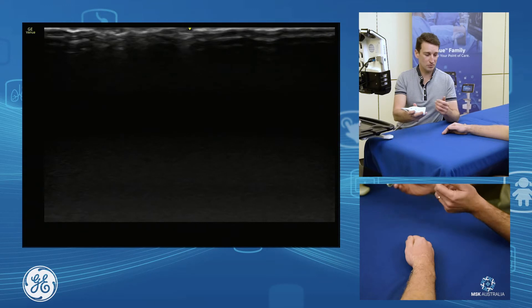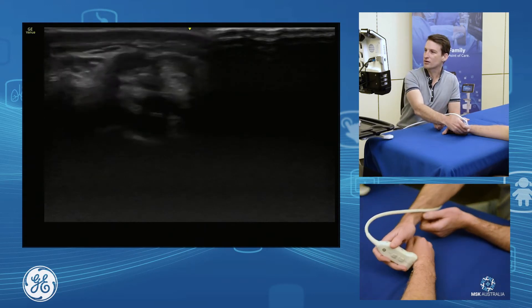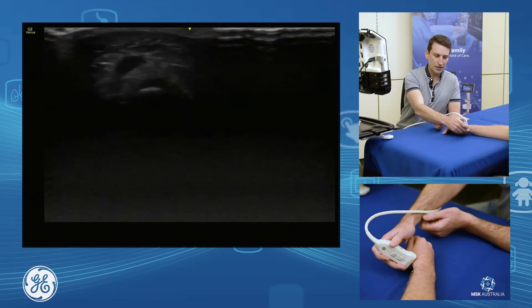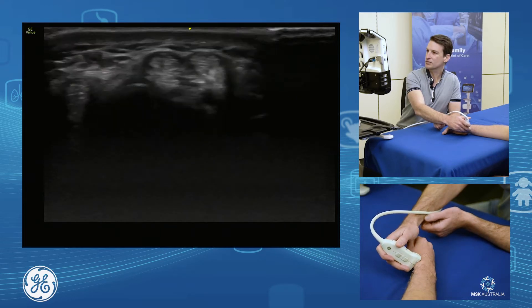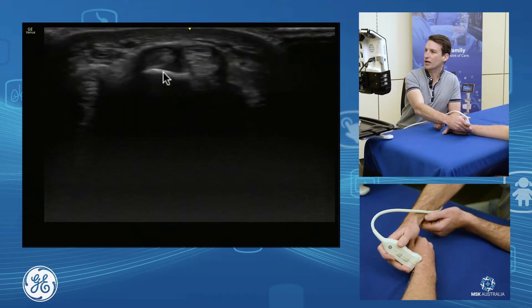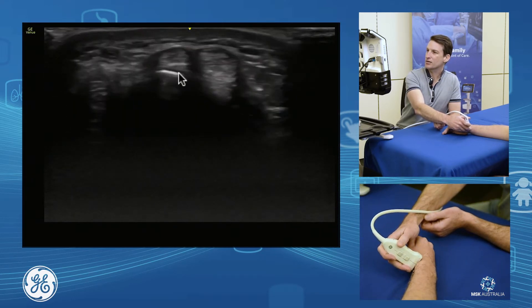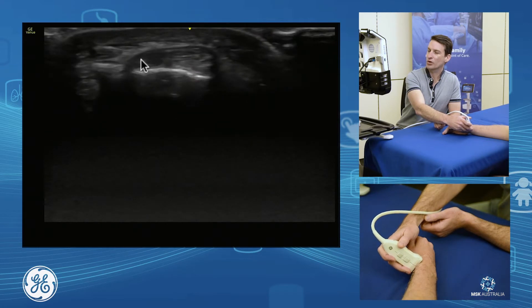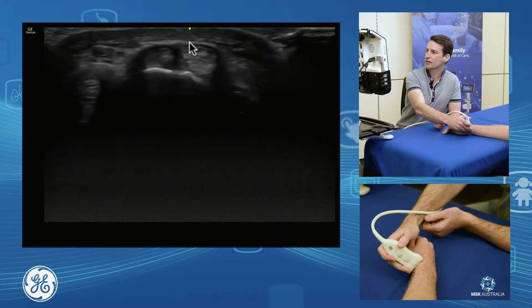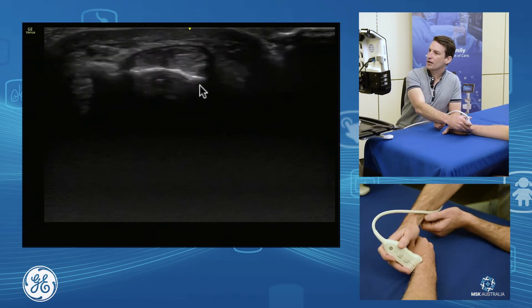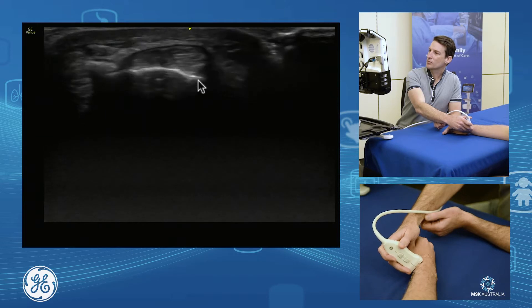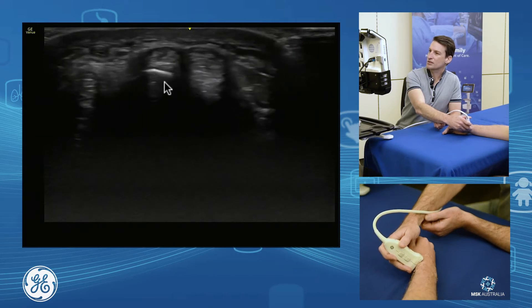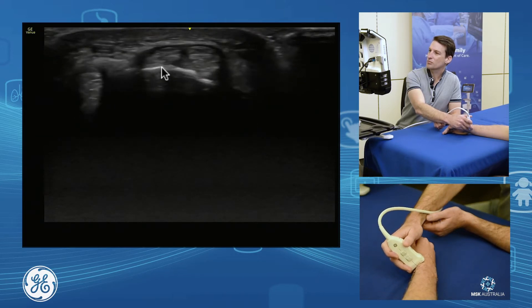We'll start with compartment one. On our radial aspect, coming from our lateral radius onto our styloid, we've got extensor compartment one being held down by our retinacula. We have abductor pollicis longus and extensor pollicis brevis.